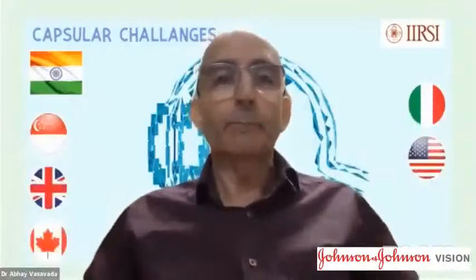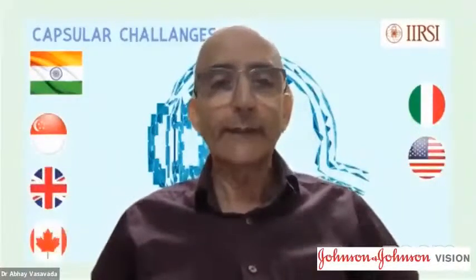Well, I don't think so. The capsule ring will spread the posterior capsule, as you said, and will remove the posterior capsule striae. But what we are looking for is a push or a pressure on the entire bag capsule zonule complex, both the capsule, the anterior, the equatorial, the posterior, and the zonule complex. So I think anterior capsule capture will have some impact, but really I would think this is not the best thing.